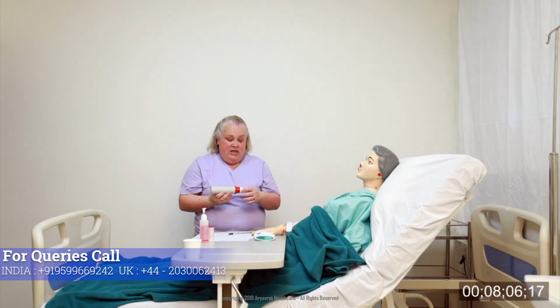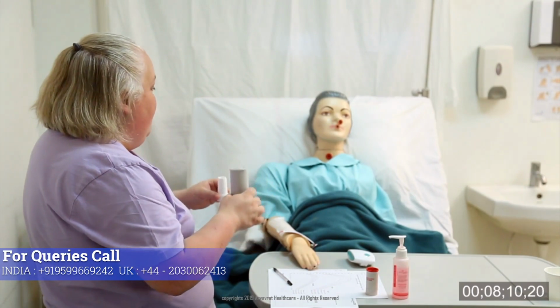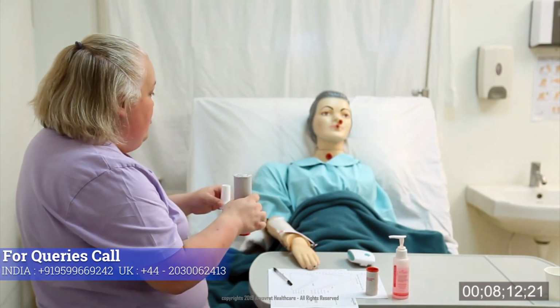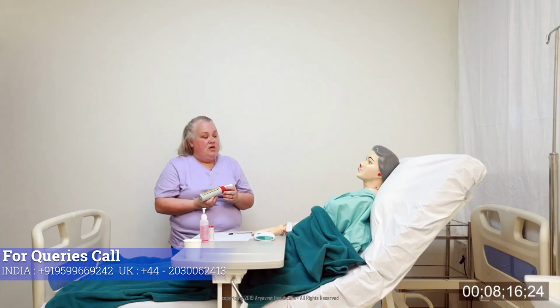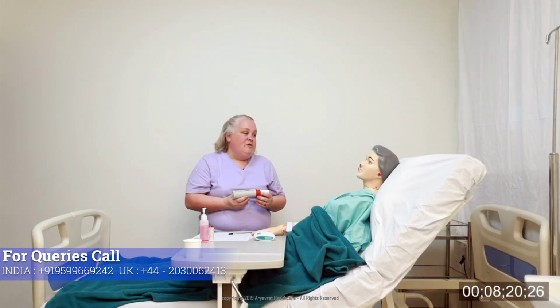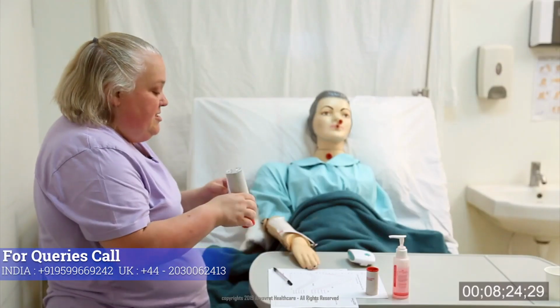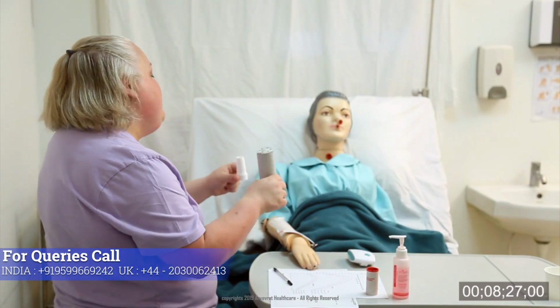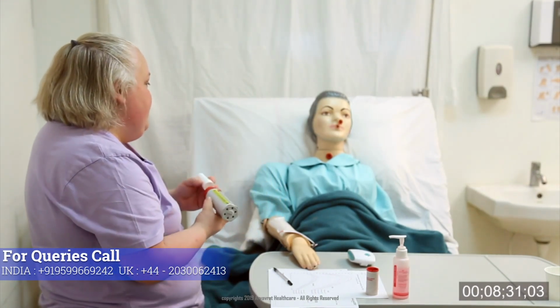Okay. Then after every 30 uses, you need to do a thorough cleaning with soap and water, and then use some sterilising solution. Okay. So something similar to Milton or something like that, that we use for sterilising baby bottles. Oh, yep. I know them. Yeah, so something like that, at least once a month. So after 30 uses, you need to do that, sterilise it, okay?